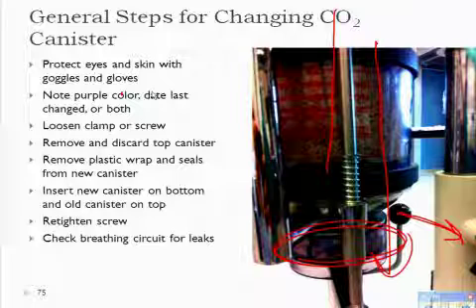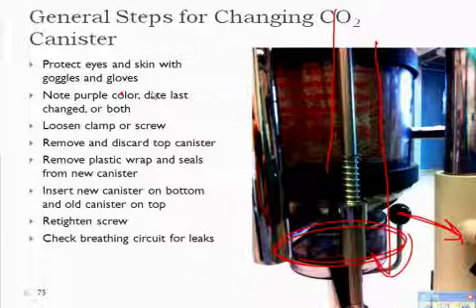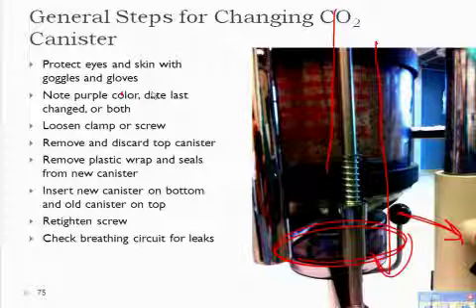When we have you guys come over next semester for your anesthesia management and we're troubleshooting the anesthesia machine, I guarantee you I'm going to do that. It's gonna happen. So when you start seeing, I can't ventilate, check your CO2. All right, see if that was a problem.